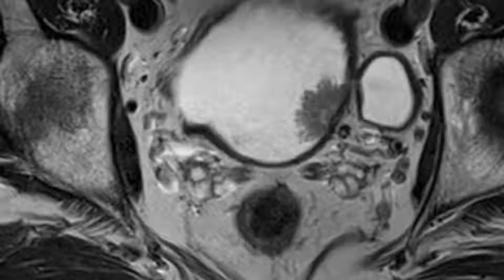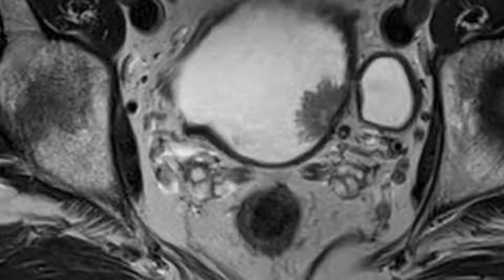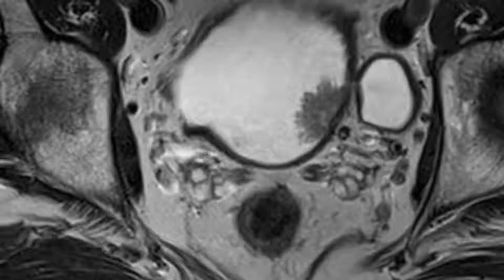A single-shot spin echo echoplanar sequence performed with chemical shift selective fat suppression technique at B values of 0 and 1000 is used. Diffusion gradients are applied in the three orthogonal directions and the images are obtained in the axial and sagittal planes. The images are usually evaluated together with the T2 weighted images.